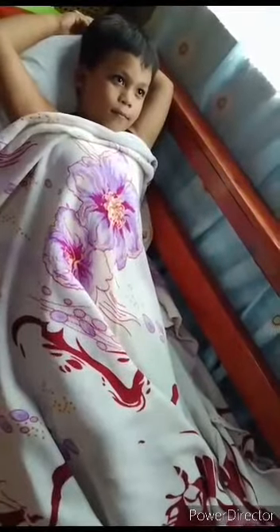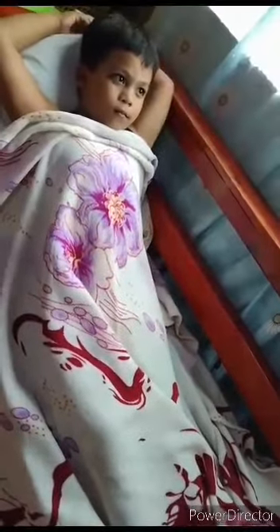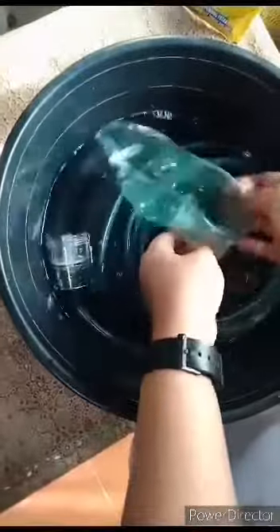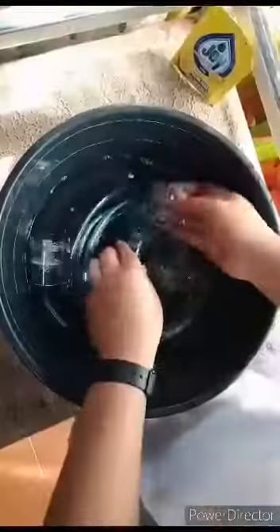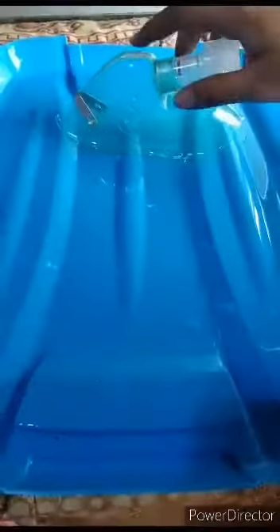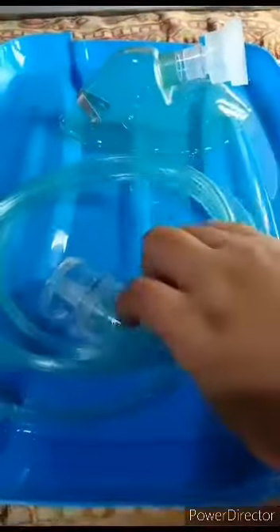Step number 13 ensures that the patient is left feeling as comfortable as possible. Bronchospasm is further reduced if the patient is relaxed and reassured. Step number 14. Wash and dry the nebulizer, tubing, and mask or mouthpiece with warm soapy water. Proper cleaning decreases the possibility of pathogens entering the client's respiratory tract.